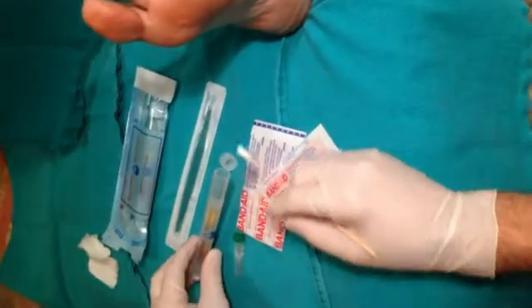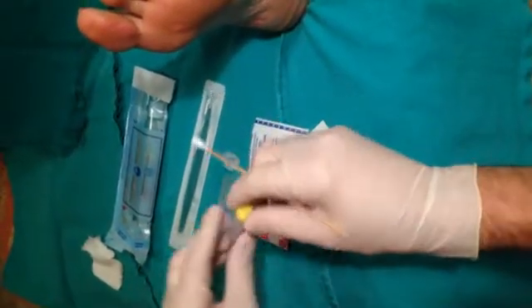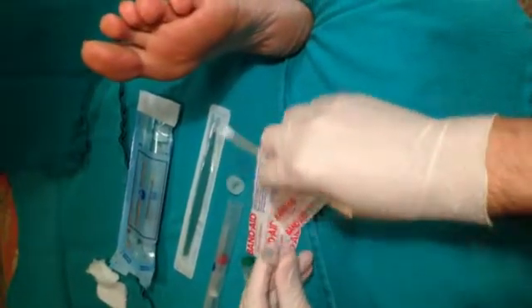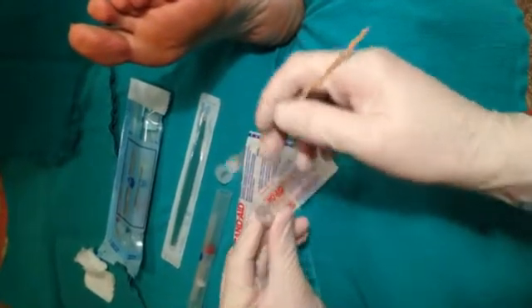Having applied the green cap solution for approximately one minute, we now proceed to the yellow cap solution. These must be placed in sequence — green cap first, then the yellow.